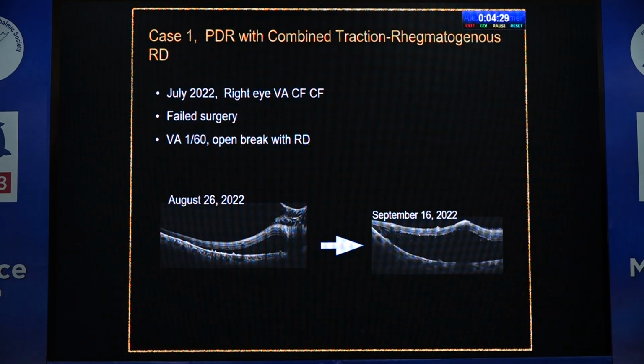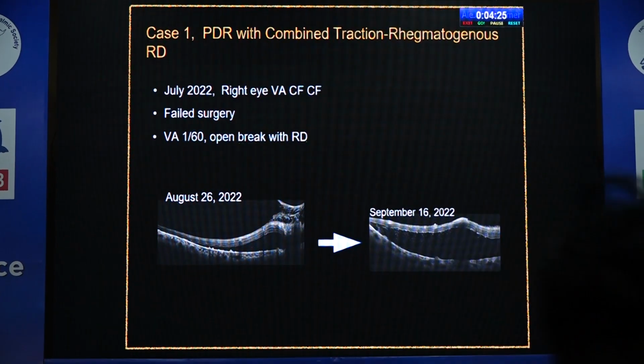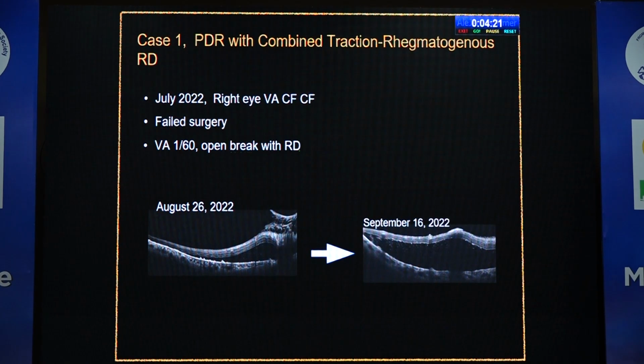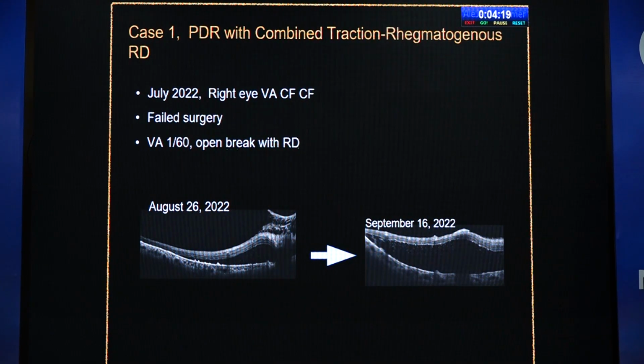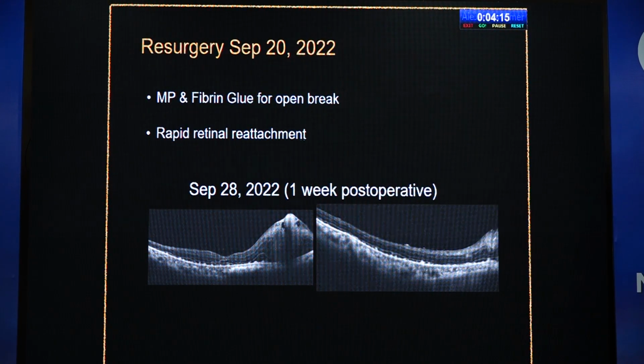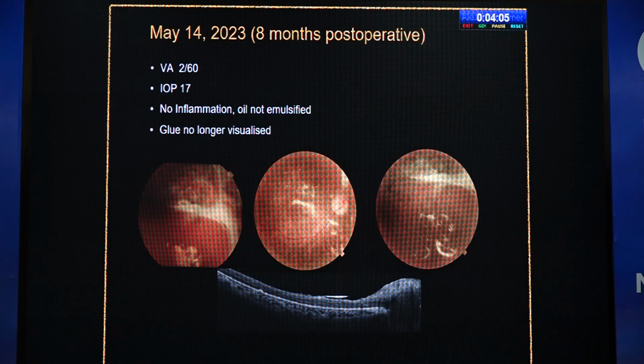So we had this patient who had a failed retinal detachment surgery for complex PDR. Oil was already in the eye. So we thought we have nothing to lose anyway, she will be losing her vision. There was an open break which was causing this. So after a little bit of membrane peeling, we put fibrin glue to close the break, and there was an immediate retinal reattachment with minimum positioning.